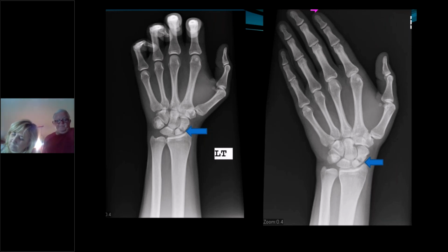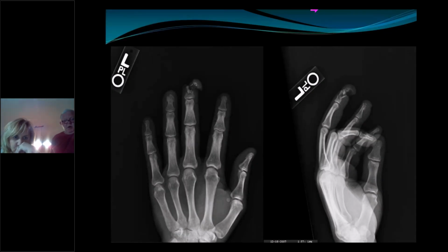So if you have a patient that has scaphoid tenderness or navicular tenderness and you're worried about it, when you order your x-rays, put on there scaphoid pain, or obtain scaphoid views, or 3-view wrist series with scaphoid views, and any of the radiology techs will know what that means. Because that's a very common thing to order, and sometimes it can help identify, especially if it's not real easy to see. Sometimes those ulnar and radial deviation views can give you a little bit better help as to whether or not you truly have a scaphoid fracture or not. So x-rays can be helpful.